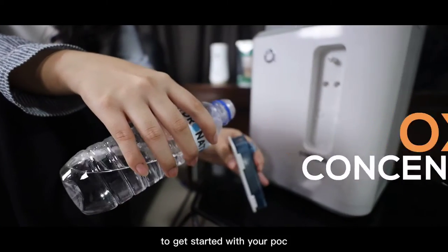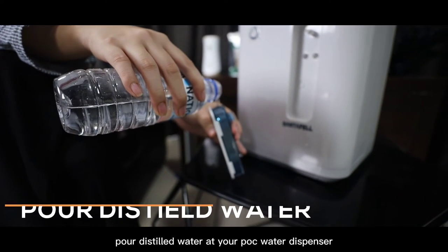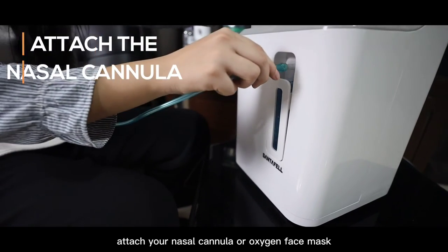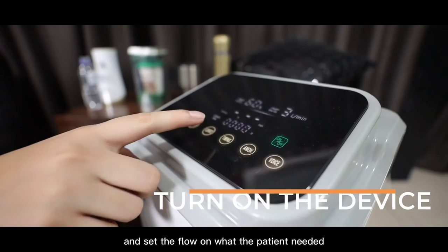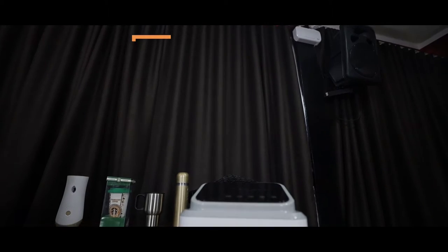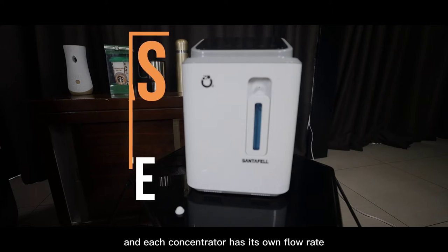To get started with your POC, pour distilled water at your POC water dispenser. Attach your nasal cannula or oxygen face mask. Turn on the device and set the flow to what the patient needs. Each concentrator has its own flow rate.